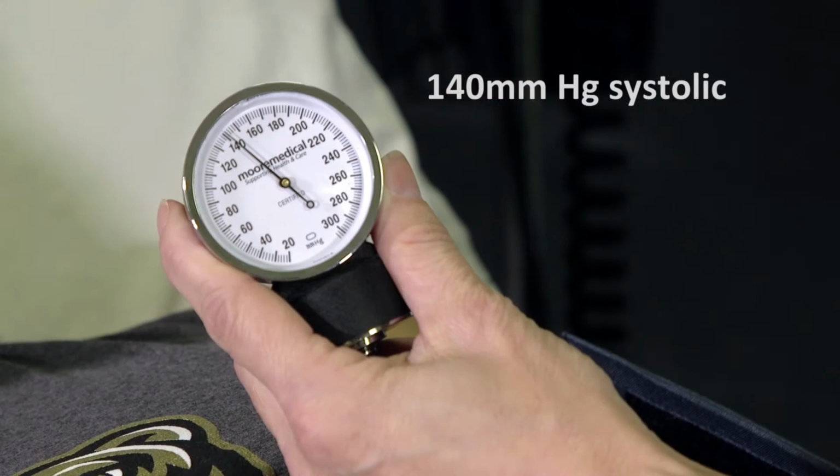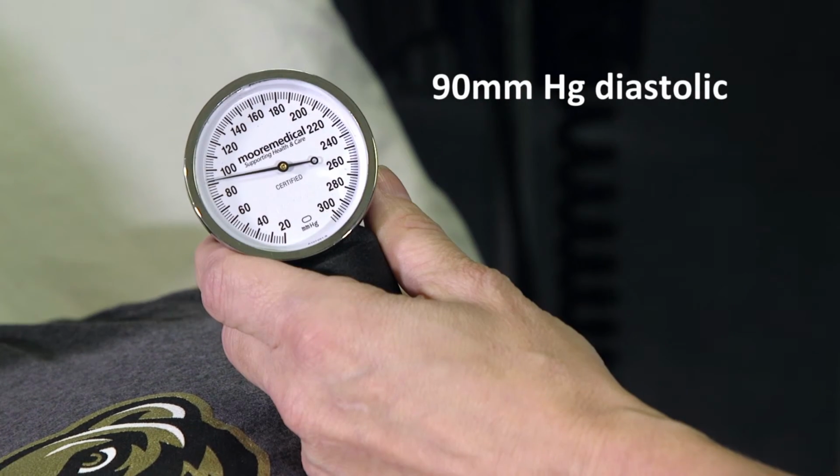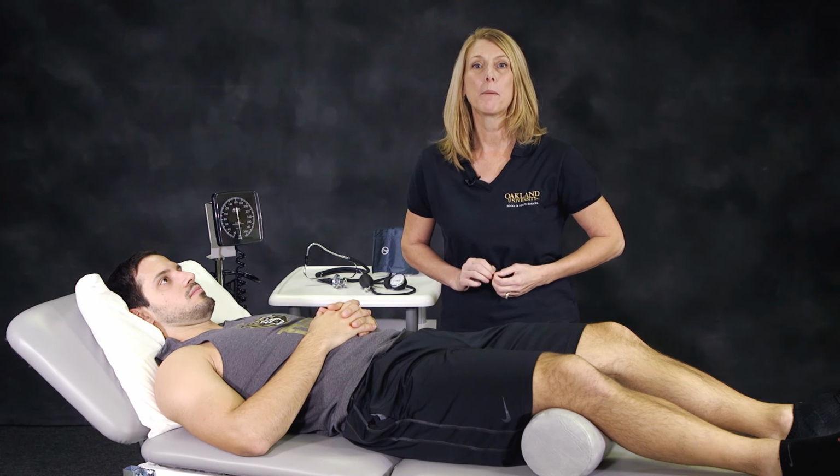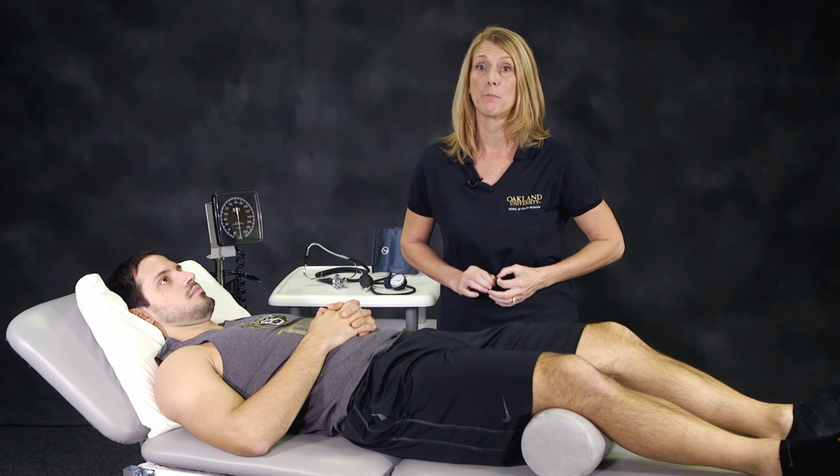Finally, it is important to recognize that the diagnostic and category values established in the literature, for example, 140 millimeters of mercury systolic and 90 millimeters of mercury diastolic, indicative of a hypertensive measure, are determined from an upper arm measure, and substantial variability may exist in varying parts of the arterial tree. Specifically, the systolic pressure may increase in more distal arteries, whereas the diastolic pressure would decrease. There can also be variability between the sides of the body at which the measure is taken. Therefore, regular measurement at each physical therapy encounter is recommended to establish each individual's blood pressure measurement and ranges.